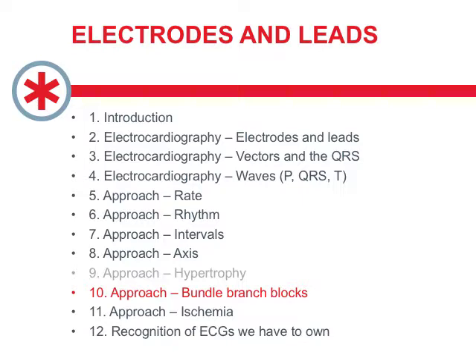Anyways, this lesson is sort of funny in that it is the one that actually has spawned the visit of the electrocardiography aspects of things, and has really kind of been the genesis of a lot of the deep dives we've done. Insofar as I got asked during these lessons to actually tackle bundle branch blocks. For most of us, we usually have a look, we see the cardiogram, and we recognize a right and a left bundle and what they look like. But there's always the inquisitive minds who then ask, well, why does the ECG look like that?